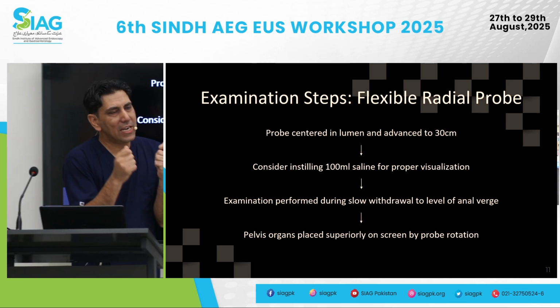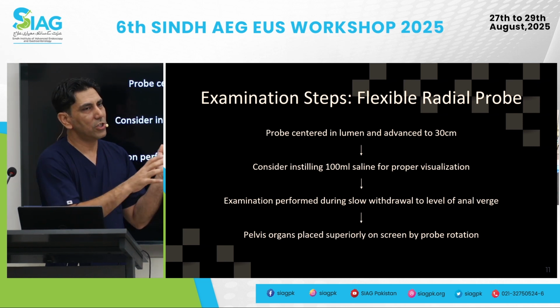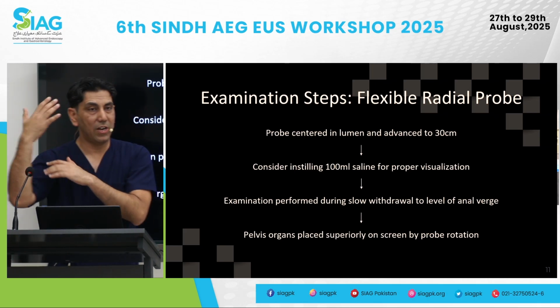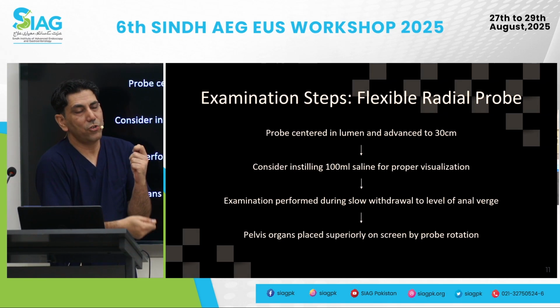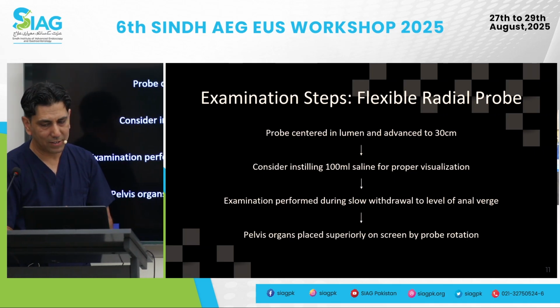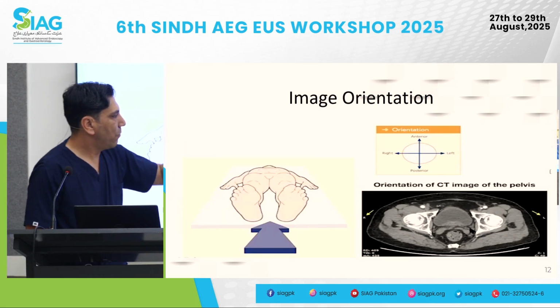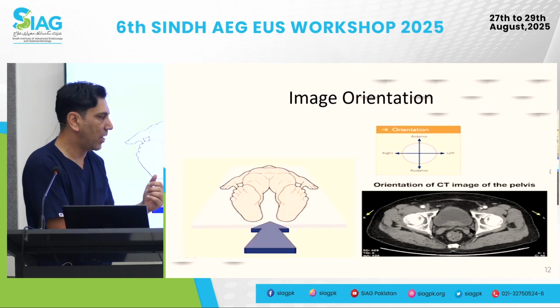Here, because it's slightly different and it's not something that we do quite commonly, you need to just orientate yourself. So you may want to have an image on the monitor which is accessible, or an iPad if you have access to it, and then you orientate yourself in that patient position, especially if the patient is lying on the left lateral side. So again, with this image, when the patient is lying in this position, where's your probe, anterior, posterior, left, right, which side are we looking at?